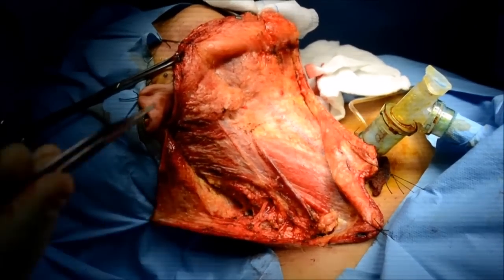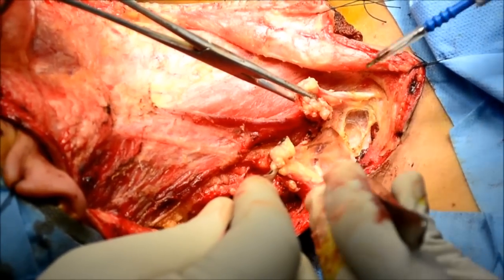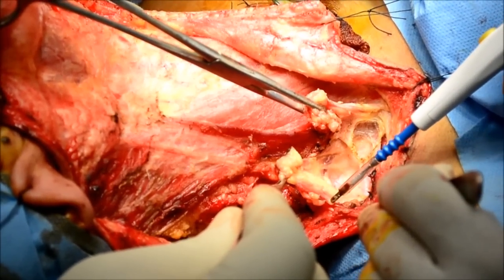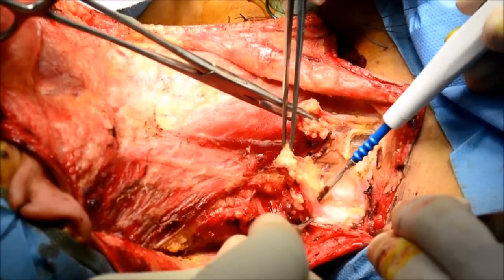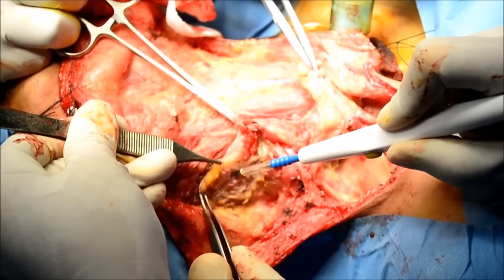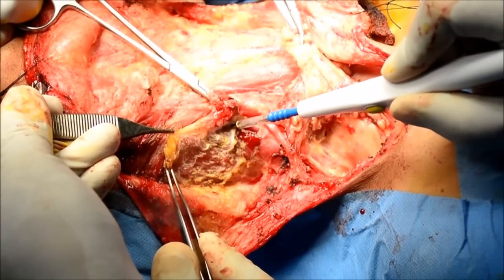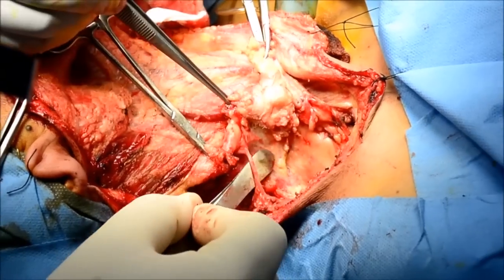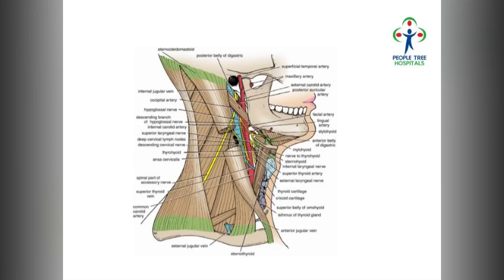You start from the apex and then slowly come lower down to clear the supraclavicular fat. The supraclavicular fat is cut from the clavicle and a plane is created. Once you cut the lymphoareolar tissue, one of the important muscles you would see is the omohyoid muscle. This anatomy tells you the amount of clearance needed from the trapezius to the posterior border of the sternocleidomastoid.